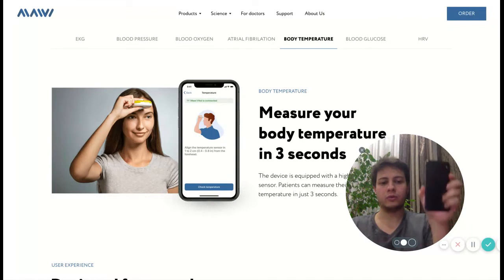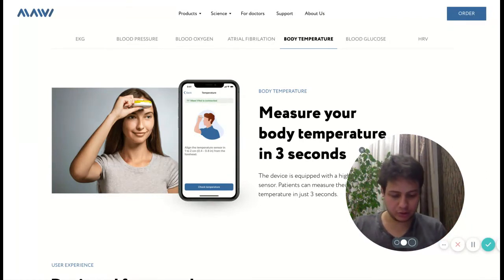Just use your mobile phone and your application. Select body temperature, then tap next.